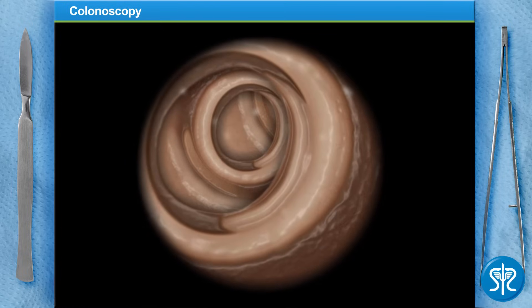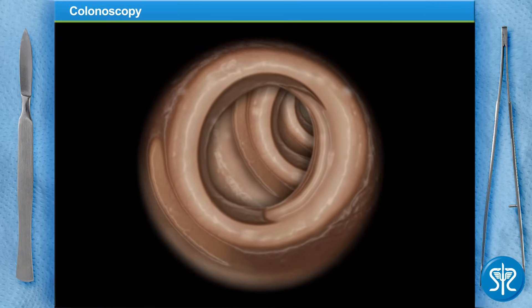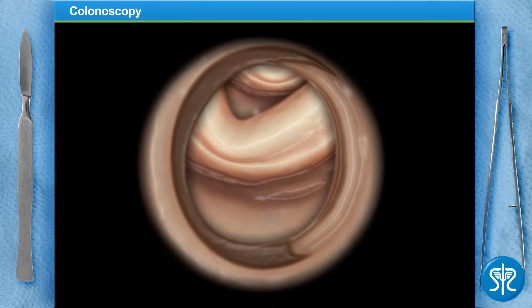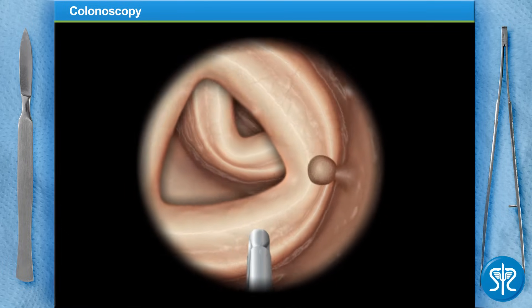Back in the transverse colon now — everything's looking fine. Now is also a good time to remind our patient to breathe through her mouth slowly. Moving now into the ascending colon, and there's another one — let's take it out the same way we did the other.